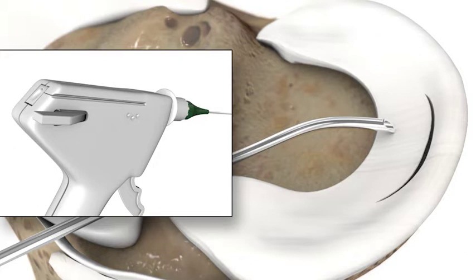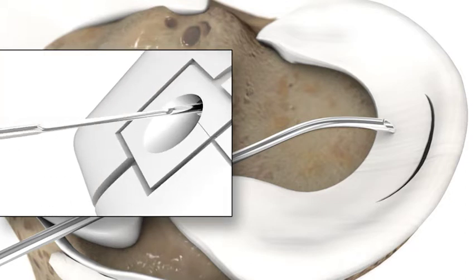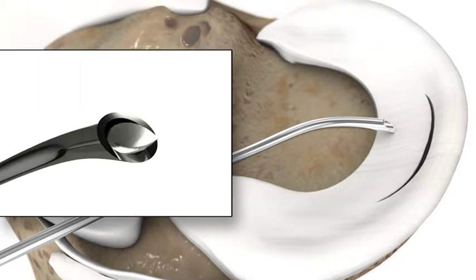To load the first needle, depress the thumb lever on the Sharpshooter handle to insert the needle into the gun. When the flat of the needle is at the entrance of the gun, the needle is just about to exit the cannula.